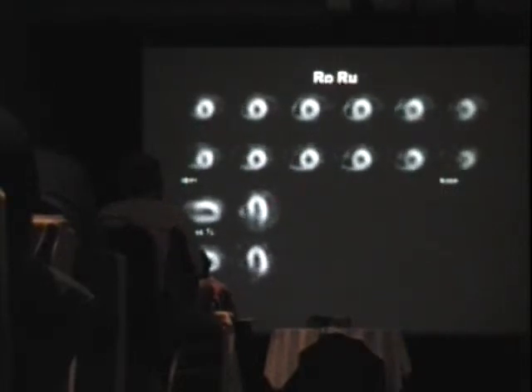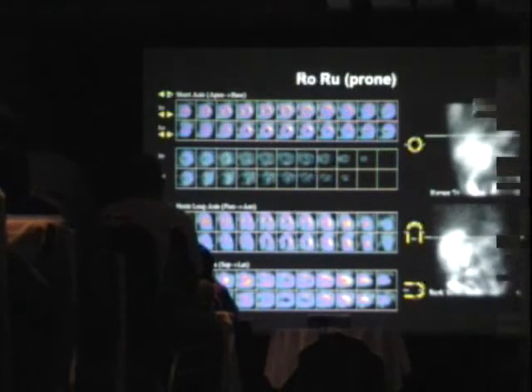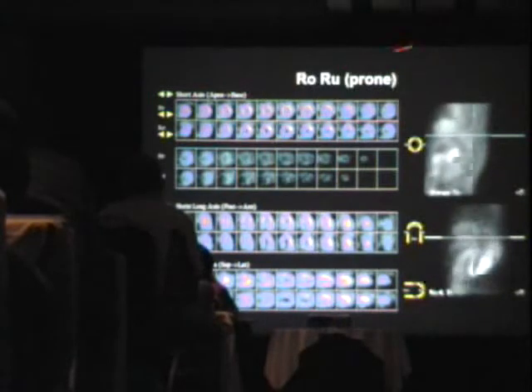And even though the perfusion images are reflecting the perfusion state at the peak exercise, the gated images are reflecting cardiac function at the time you're actually acquiring the images, which is 30 minutes post-exercise. And typically, you could have transient ischemia, which is no longer affecting cardiac function 30 minutes later. So now, what do we do? We prone the patient.